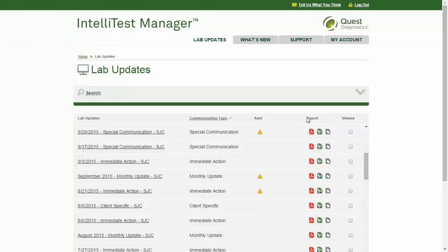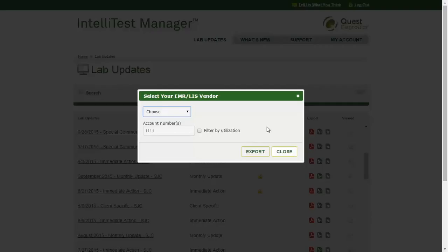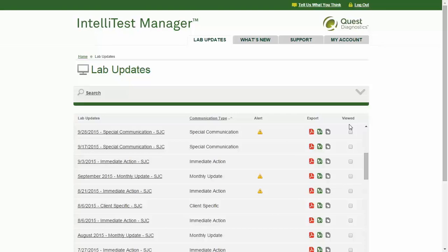Your options are to view the communication as a PDF or Excel file, or click the last icon to select your vendor-specific product and export an Excel file in the format specified by your EMR or LIS vendor, which may facilitate loading test updates into your system. The last column allows you to select a checkbox indicating that you have viewed the communication. If you check that box, it will automatically be unchecked if a revision is published, helping you quickly identify what to review when you log in.